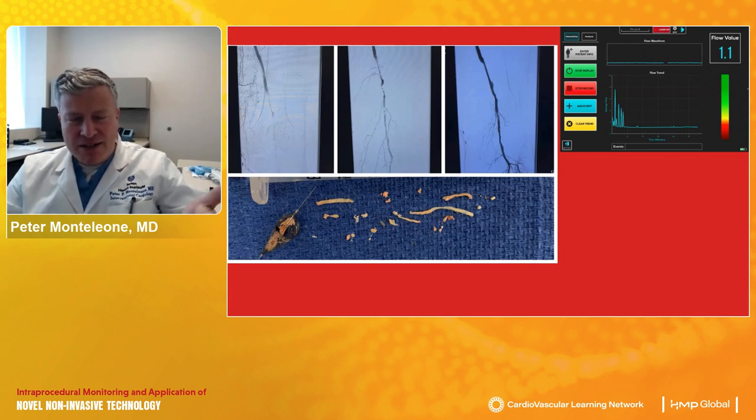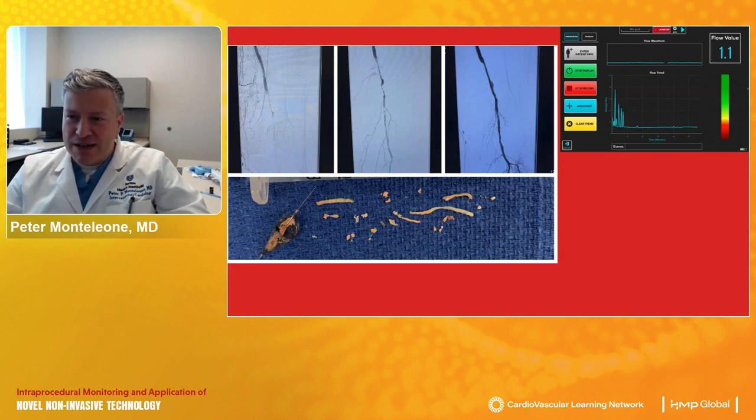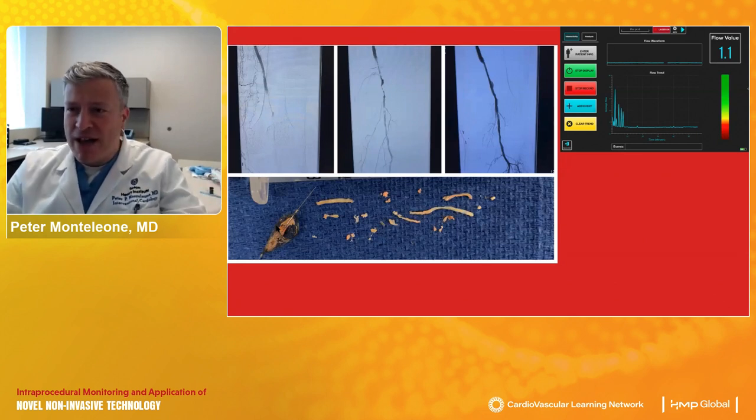Instead, what we found out is this was someone who actually had diffuse adductor canal through P3 segment disease. Some prior operator hadn't been able to push the stent all the way down. So they pushed it as far as they could, they deployed it, and there was still heavily, densely calcified disease distally with stent on both layers. We did our best in this situation.